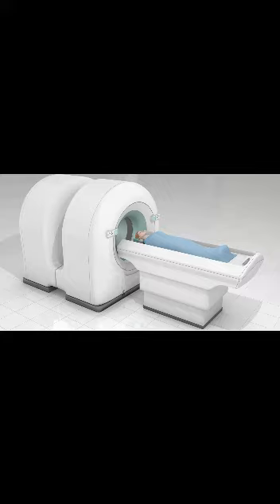PET scans detect areas of activity, like cell growth, in the body. More radioactive material collects in cancer cells than normal cells and will appear brighter on the image. Not all cancers show up on a PET scan. PET scan results are often used with other imaging and lab test results.